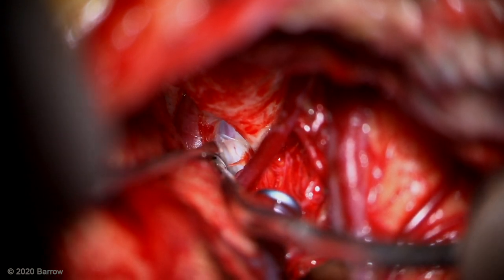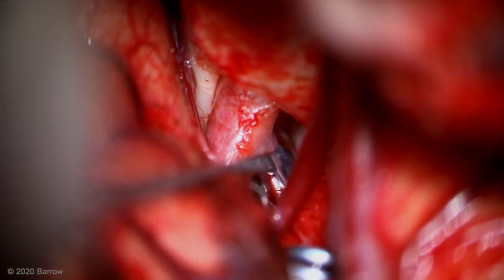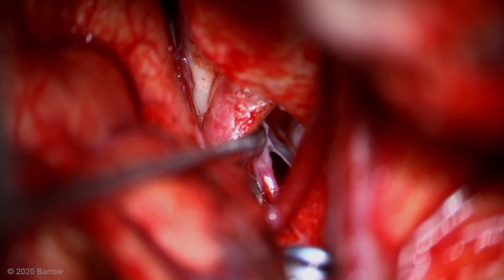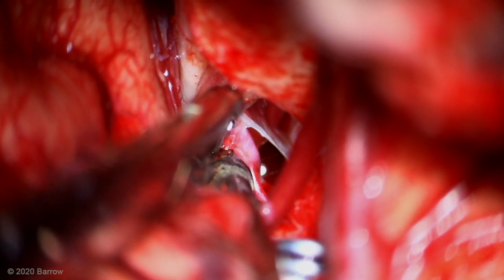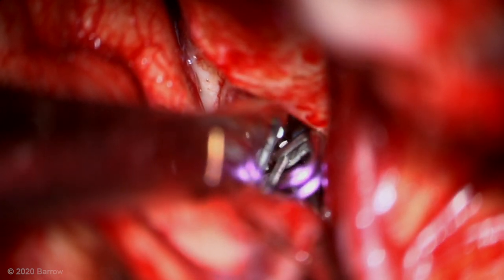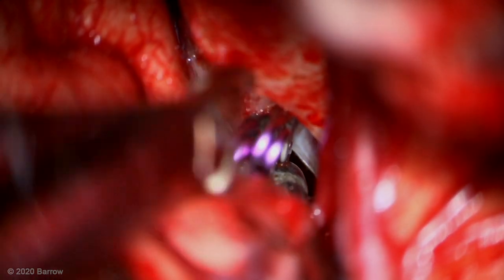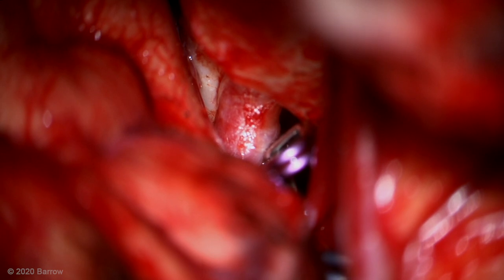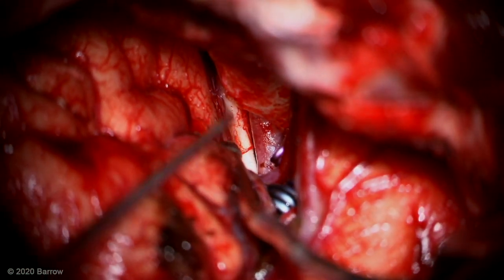The patient's posterior communicating artery was infundibular in its shape, but it had a thinned wall with a cherry red color and some bulbousness that was suggestive of an early aneurysm forming there. Therefore, I clipped the aneurysm. A straight clip was applied, but it slides over the dome and does not get a good purchase. Using a second clip under the first clip as an anchor or foothold, we can then get a deeper application and better purchase, securing that bleb of the posterior communicating artery. Here now is an overview showing the view down the sylvian fissure with preservation of the veins.